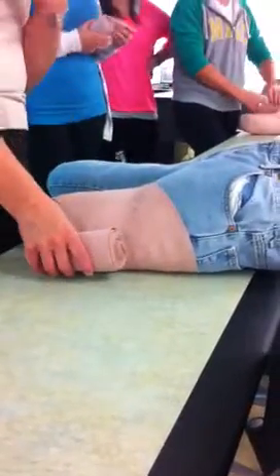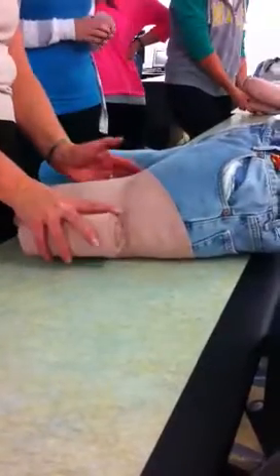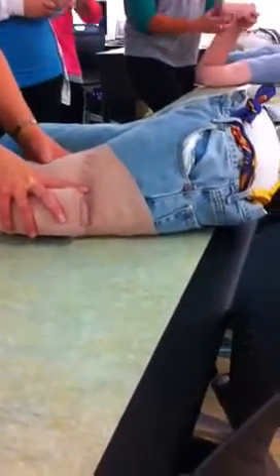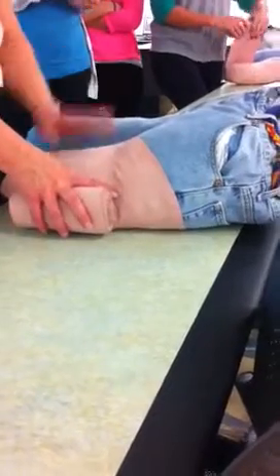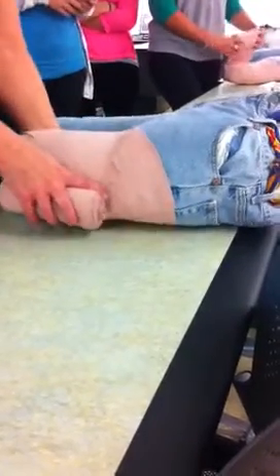So again, just start out with explaining why, explain the purpose. We really need to get up here because this is so important. We want to make sure that you can get into a prosthetic device later on. We need to shrink this down. So, I'm sorry, I'll apologize ahead of time. I don't mean to. Usually when you set it up that way, people are fine with it, especially if you ask them to kind of help you out.